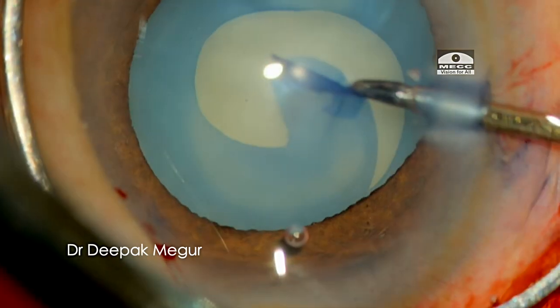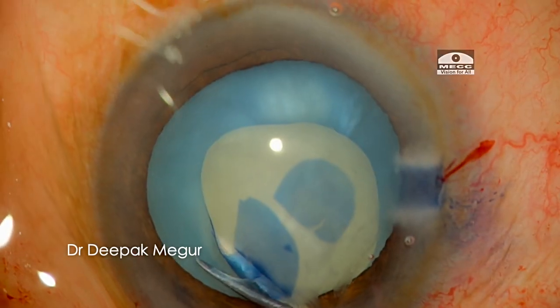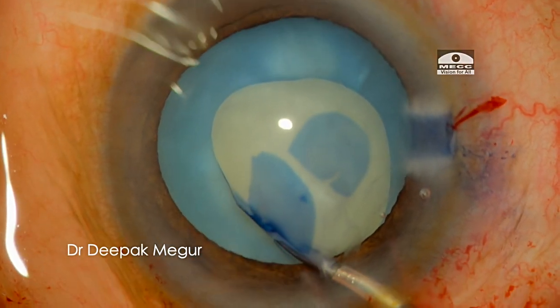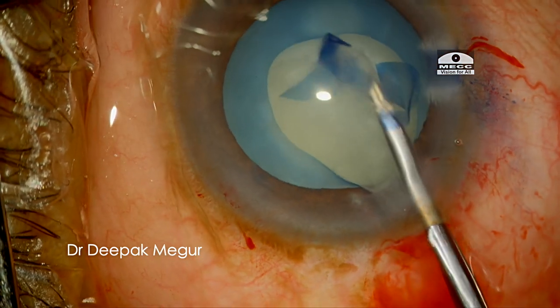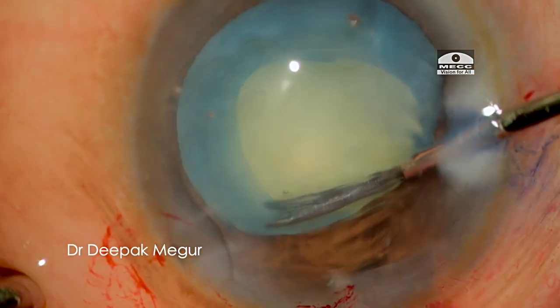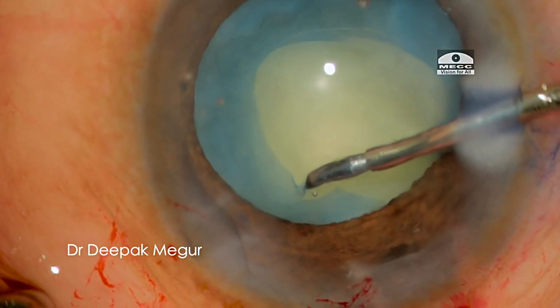We have a situation at hand now, so we need to proceed. I use scissors to cut the flap and enlarge the intact portion of the rhexis. I decompress the bag by aspirating out the soft lens matter before enlarging the rhexis, and the capsular opening is enlarged.